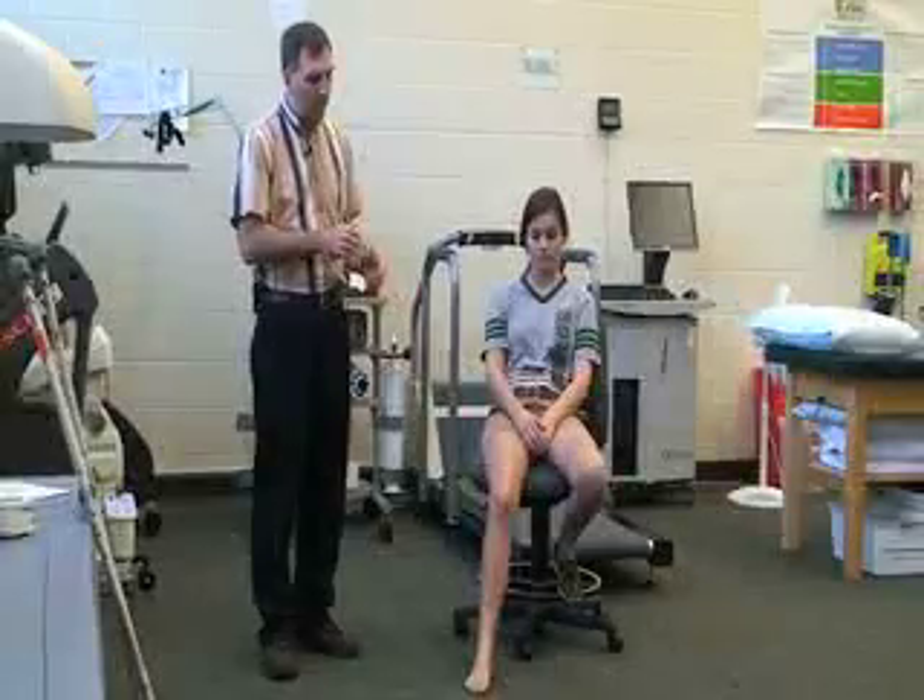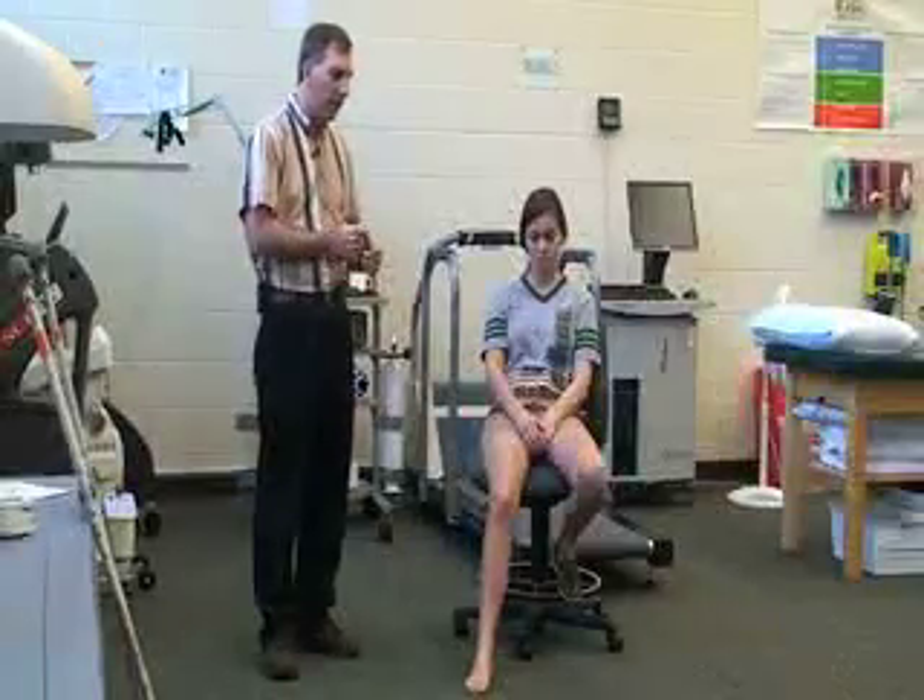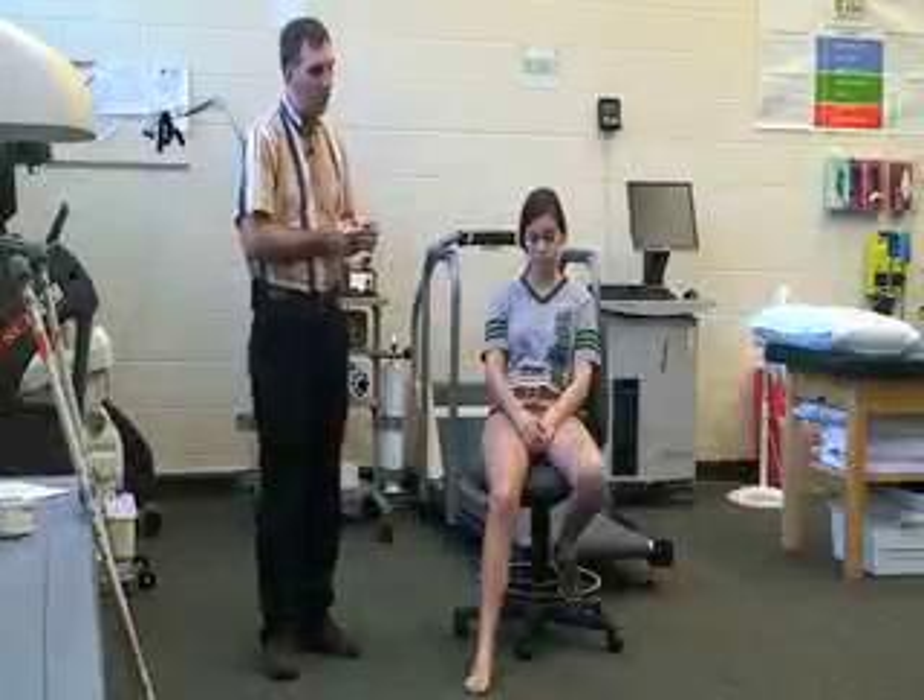Next we're going to do crutch fitting. This is for an athlete who is not able to walk or bear weight on their foot, their knee, their hip, or needs assistance walking. We're going to fit Katie for two crutches. For this simulation we're going to say that she has injured her right ankle, so this would be after the assessment where you did your evaluation and she needs to rest it or be mobile.